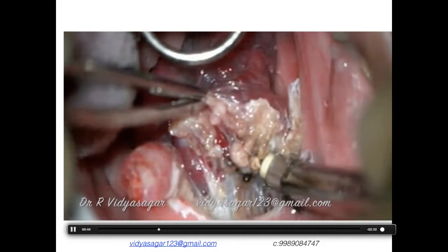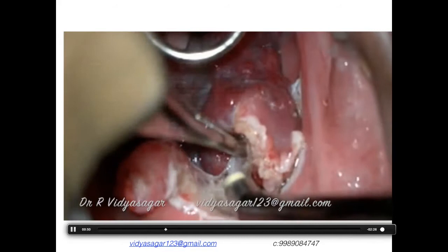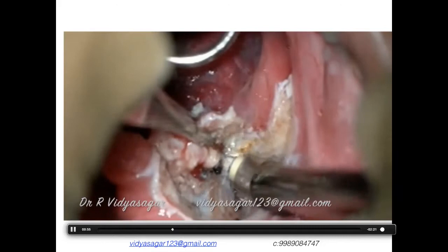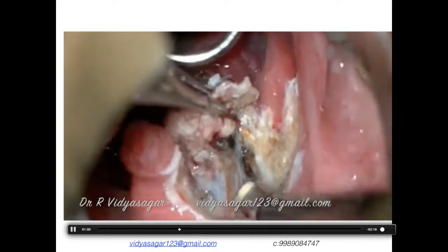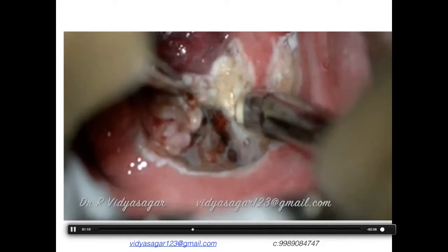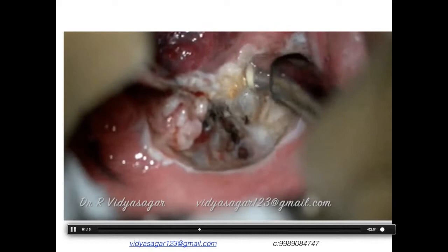After imaging confirming vascular malformation, we proceeded with coblation-assisted excision. First, we identified the root or origin from the nasopharynx or velopharynx using the endoscope, separated the lesion from the nasopharynx, and made an extended incision over the soft palate. Dividing the palatoglossal arch, we visualized the attachment going to the lateral pharyngeal wall with visible venous sinusoids.